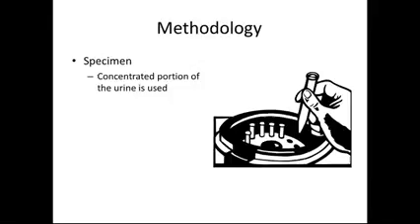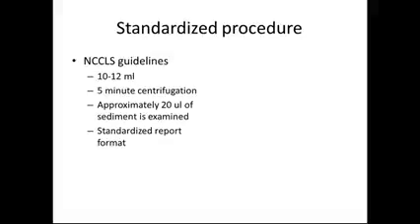So methodology, we are testing the concentrated portion of the urine. It is a standardized procedure, and we use NCCLS guidelines, which include, in the exam, 10 to 12 milliliters of urine, a 5-minute centrifuge, approximately 20 microliters of sediment is examined, and a standardized report format is used.